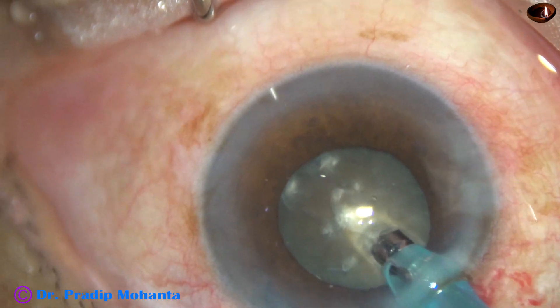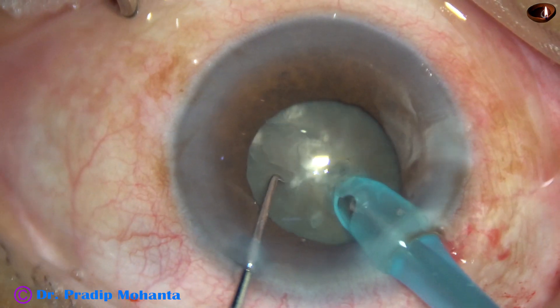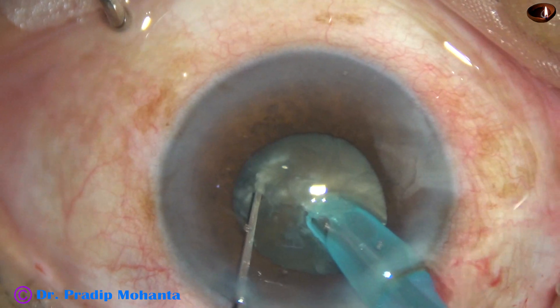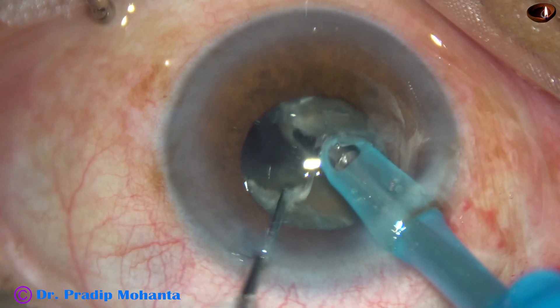The handpiece has been rotated. The bevel is off. The tube of the FACO handpiece is going through this tunnel towards the opposite equator, and the nucleus is divided here. A very nice crack.